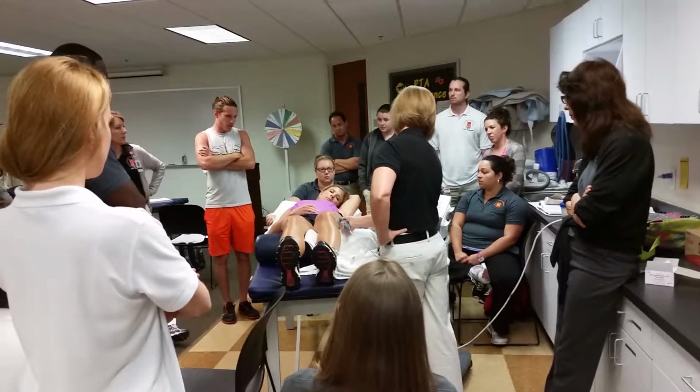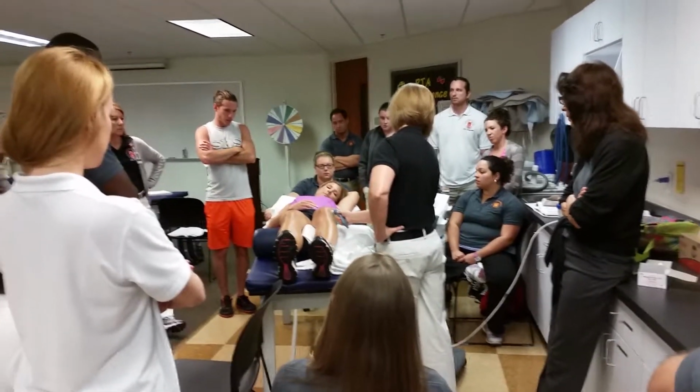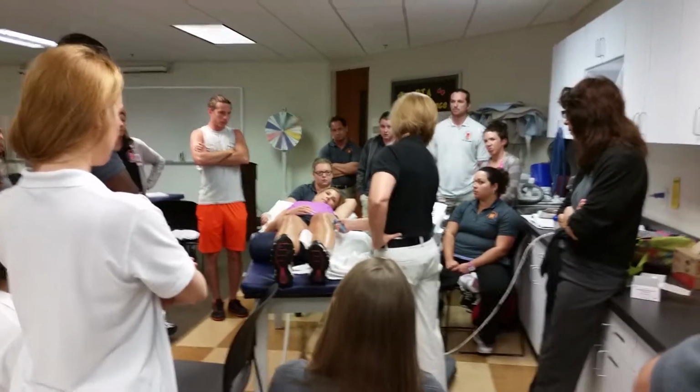Feeling anything right now, brother? Good. What are you at now? 1 watt per centimeter squared.